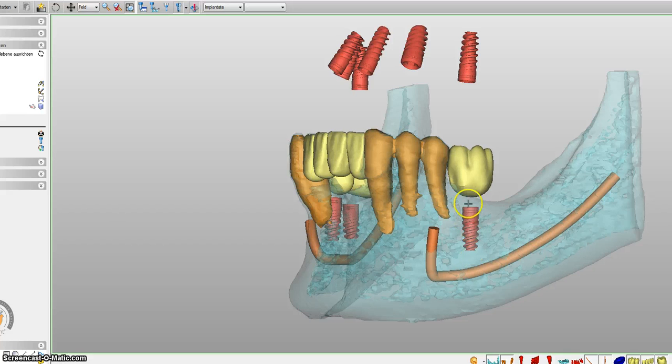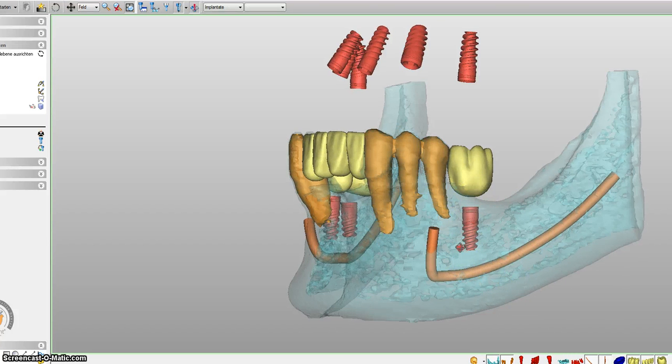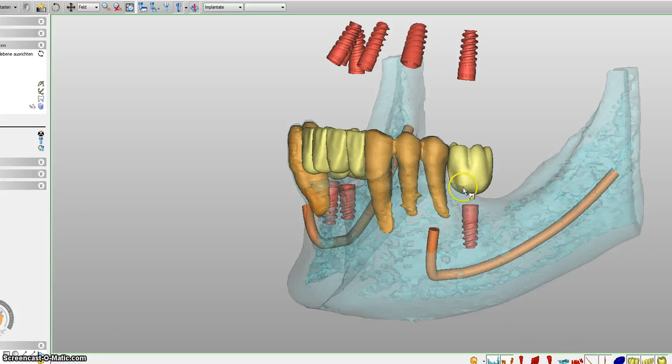And I have more than enough bone in your case, so we do not need any bone augmentation. We do not have to replace bone that might have been lost. We can just place the implant. Very simple situation. We do not even have to open the gum. We will just place the implant through the gum, so you won't even have any bleeding or injury.